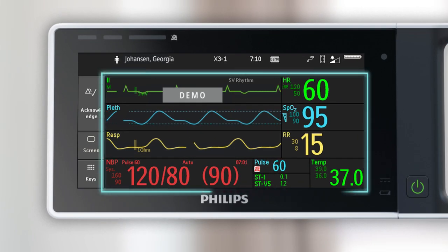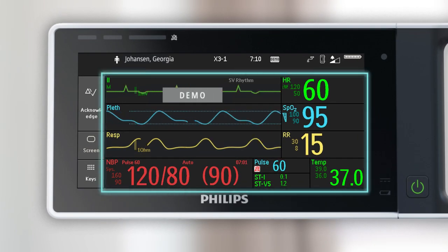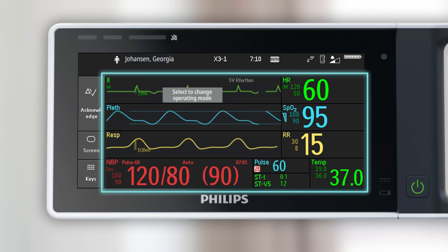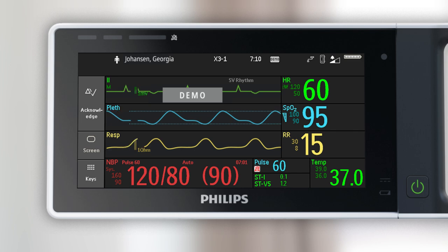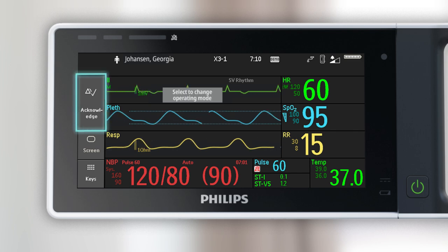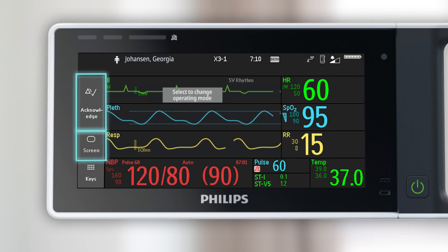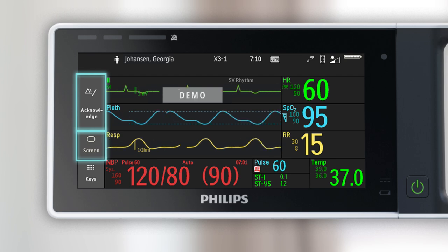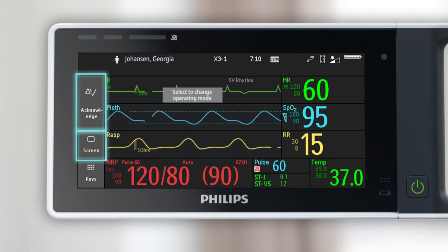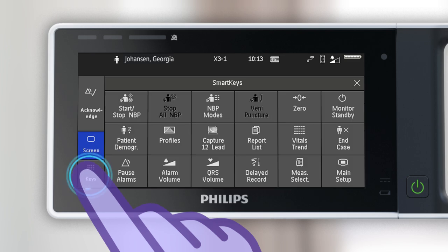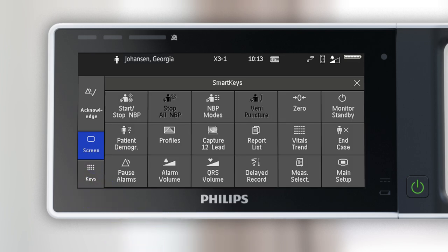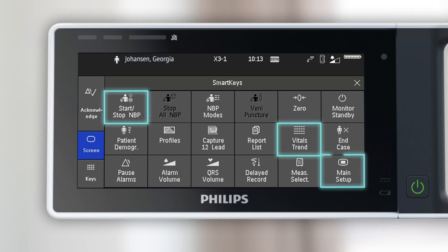The measurement area displays active clinical measurement values, waveforms, trends, and clinical applications. Several permanent keys are available on the left side of the display, including the acknowledge key for acknowledging active alarms and the screen key, which allows you to view a list of available screens or return to the main screen if a window or menu is open. Touch keys to access all available smart keys. The smart keys available on your X3 depend on your configuration, but common smart keys include start/stop NBP, vitals trend, and main setup.